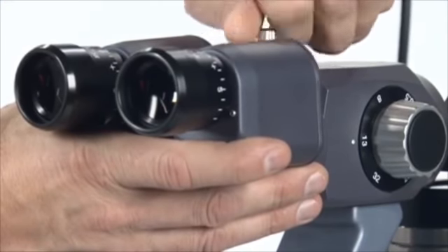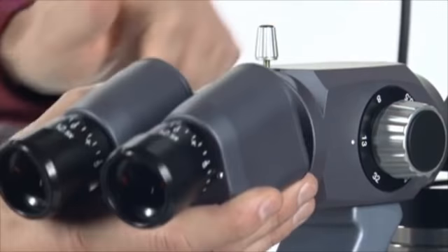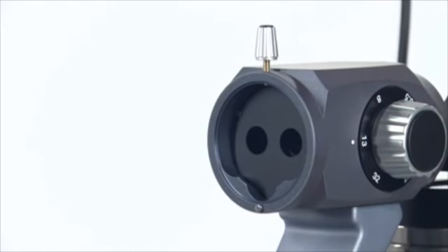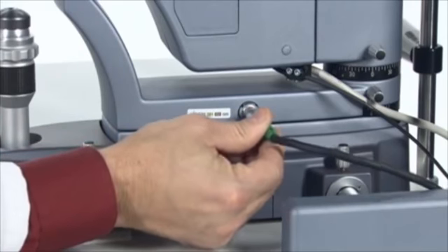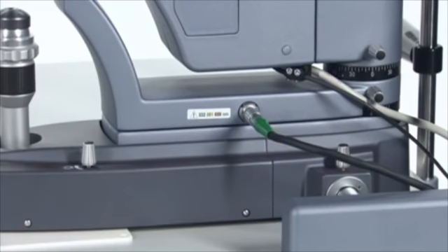safety filter into the slit lamp or operating microscope. The eye safety filter protects the physician's eyes from exposure to the laser light while looking through the slit lamp or operating microscope. Refer to the appropriate delivery device operator's manual for detailed eye safety filter installation instructions. During treatment, the eye safety filter must be attached to the slit lamp or operating microscope. Failure to use an eye safety filter could result in ocular injury.